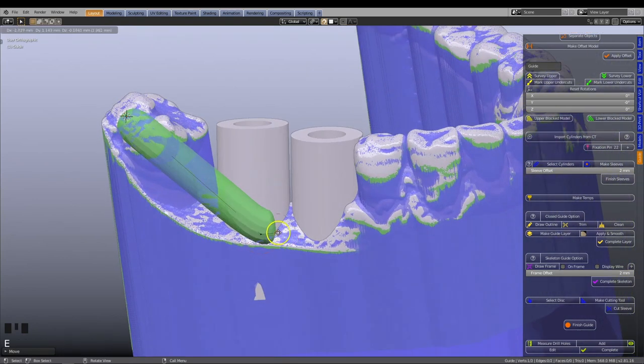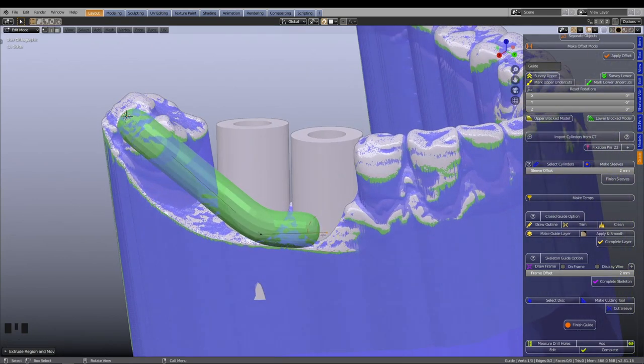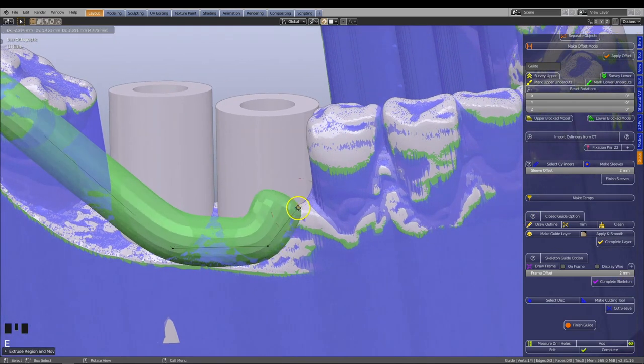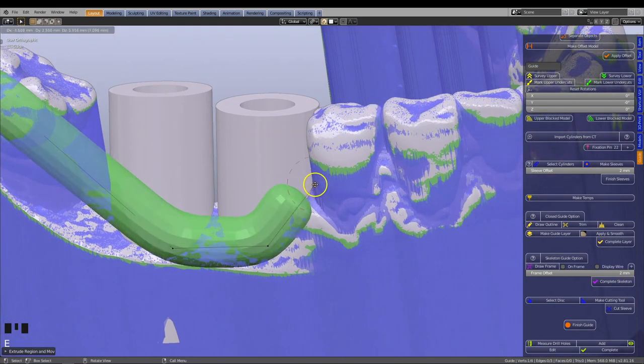We will position the line close to the lower section of the guide sleeve. Press E to extrude the line, left click to set it down.